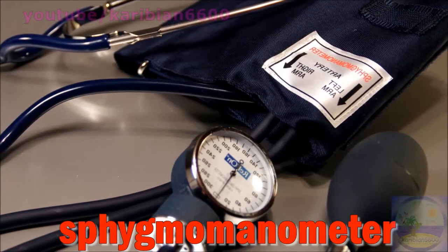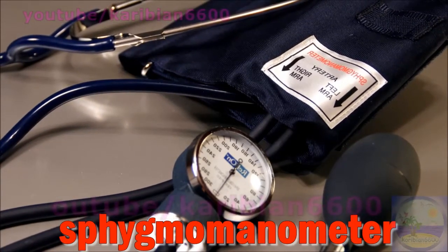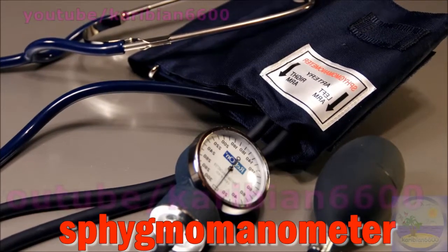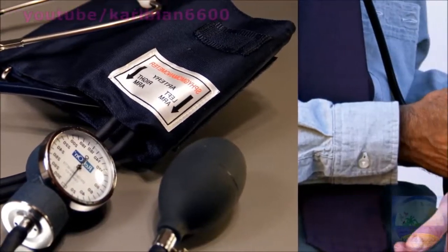The most common method for measuring blood pressure uses a sphygmomanometer, an inflatable armband with a pressure gauge and hand pump.